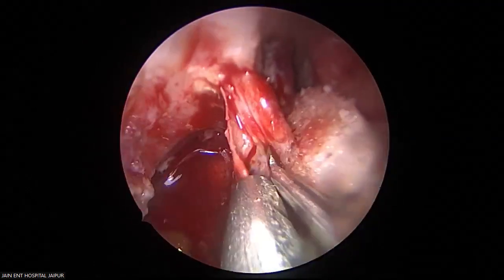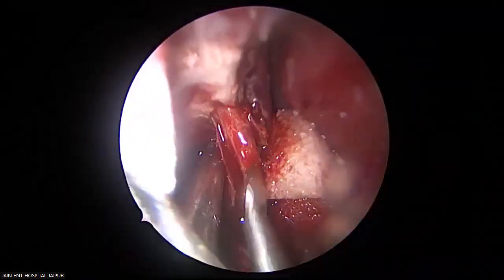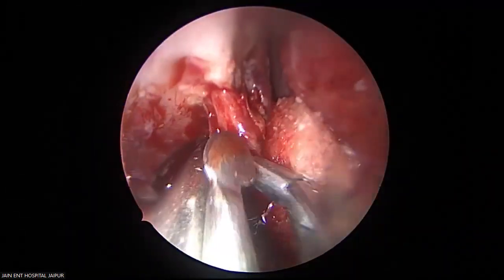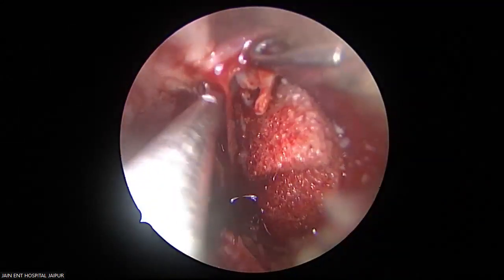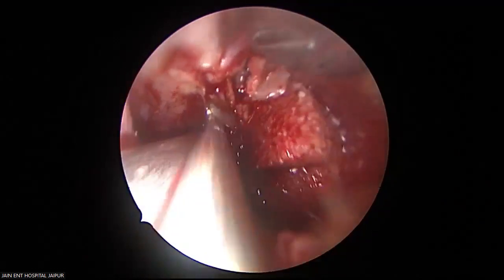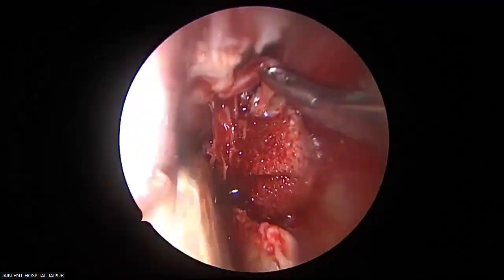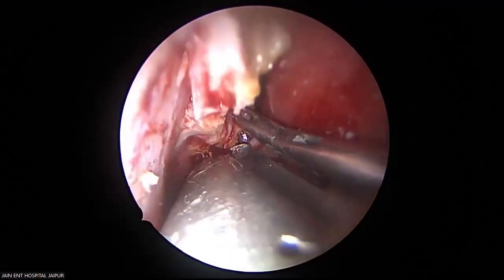Okay. See the duct within the canal? So you have to remove the bone all around.